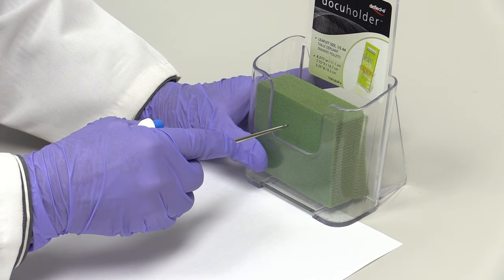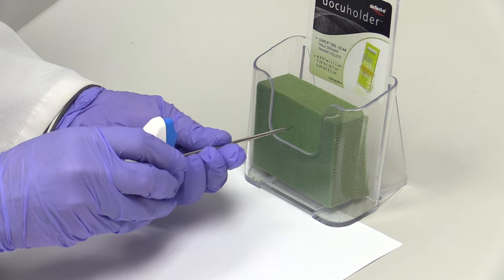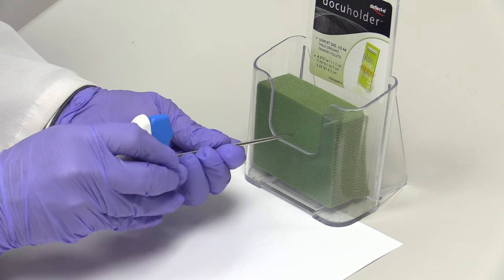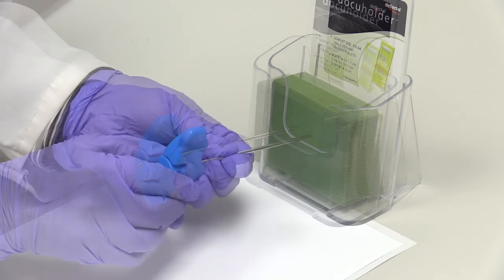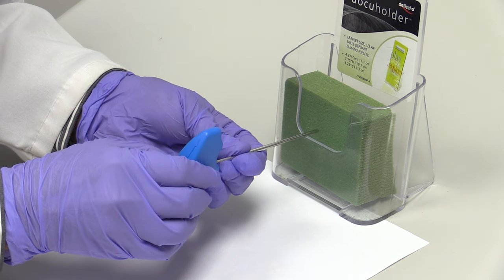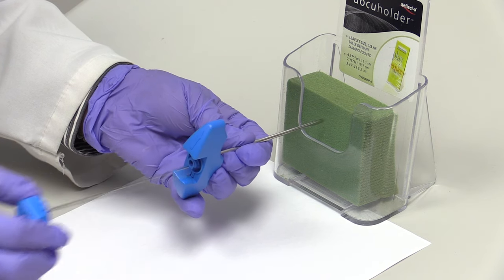Once the cortex over the posterior ilium is penetrated, hold the needle assembly in place with the left hand and remove the white protective cap with the right hand. Then, unlock the trocar from the T-bar handle by twisting it anti-clockwise and remove it from the lumen of the needle with a straight pull.